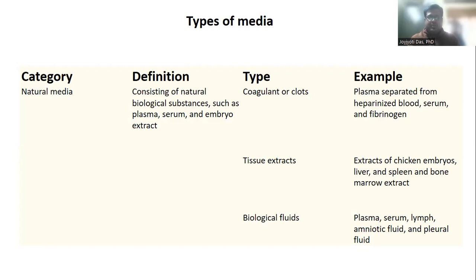Okay, so let's talk about the first category of media, which is natural media. What constitutes natural media? It consists of natural biological substances such as plasma, serum, and even extracts of embryo, which are highly rich in nutrition.